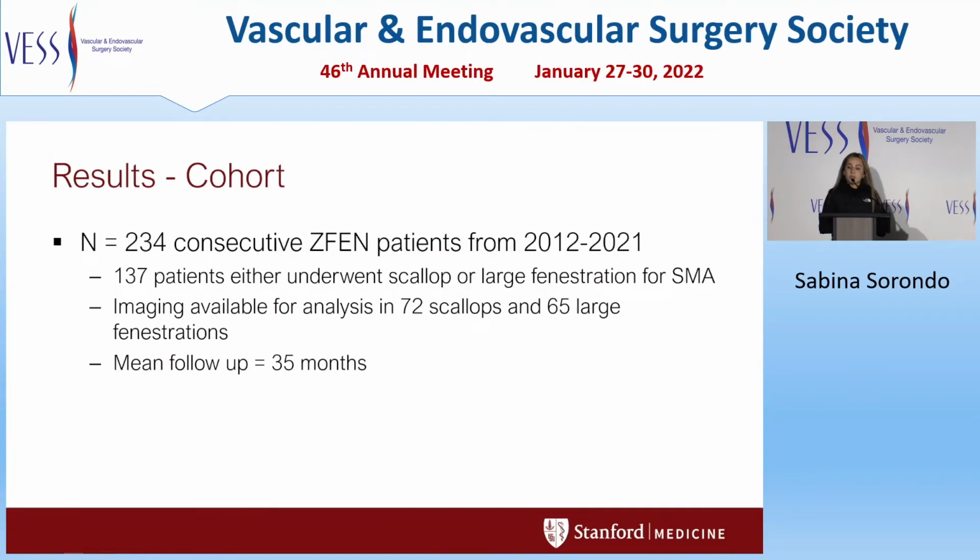A total of 234 consecutive Z-Fen patients from 2012 to 2021 were reviewed, and 137 of those either underwent a scallop or large fenestration with imaging available for analysis. So we had a total of 72 scallops and 65 large fenestrations. Mean follow-up time was 35 months.